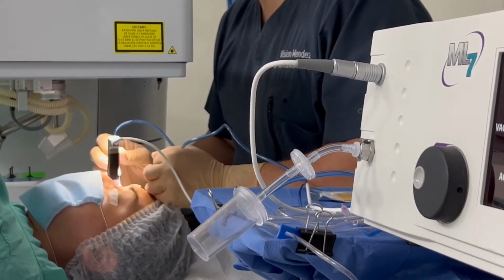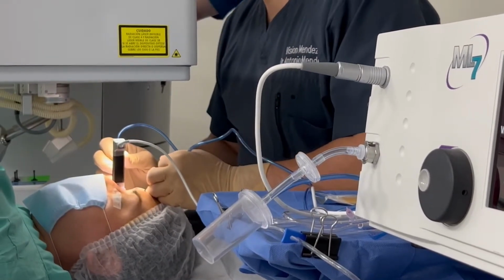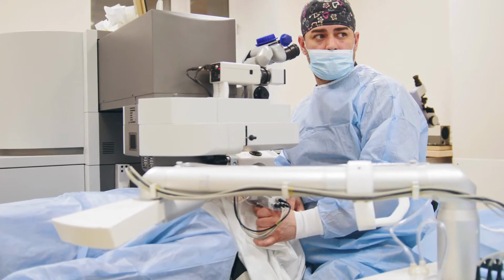At that time, the LASIK procedure used a microkeratome to create the corneal flap in the first step of the procedure. A microkeratome is a mechanical device used to create a LASIK flap. It utilizes a blade. It creates a smooth surface, which is an advantage for LASIK patients because the cornea heals faster and they recover their vision a bit faster with a smooth surface.